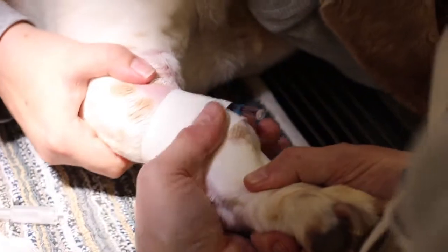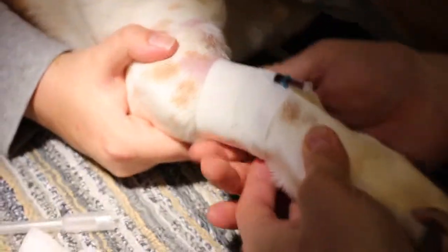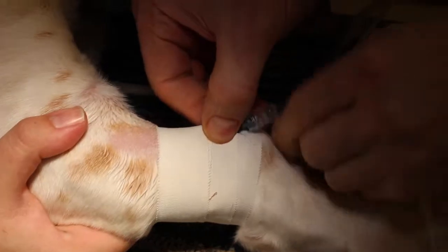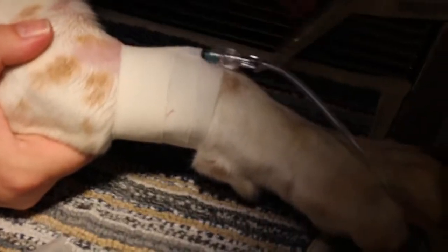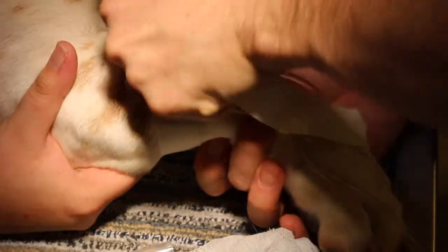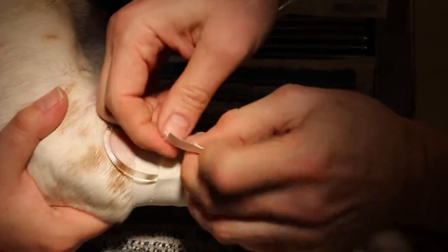I like to get a good connection here and I like to leave myself a little space. Especially with dogs that have loose skin — I feel like if you've got two wraps of tape around the skin, the skin and the catheter are all one unit, so it's not going to pull out. This one will have an IV. I like to lock this in tight because I'm not going to access it again anyway. I'm going to tape it up — make this all one unit. Then we'll put one more wrap on here.